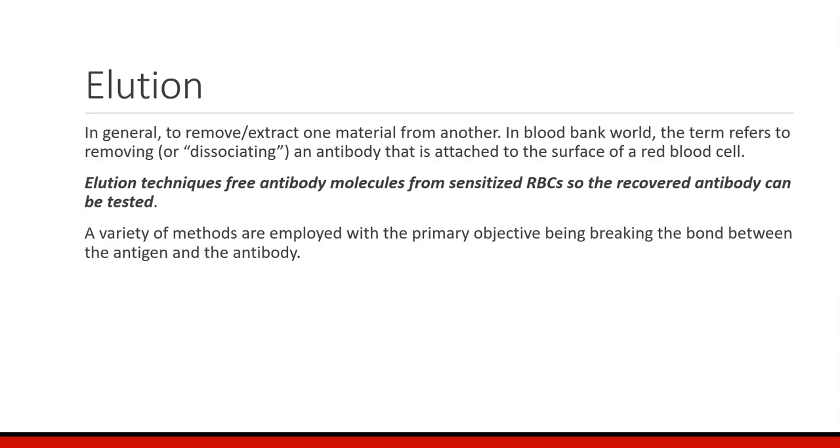We used to do these all the time, especially for ABO hemolytic disease of the newborn, because there's a very easy technique that we can do, but these have become less frequently used. And when we get to that section, I'll talk more about why elutions are not as necessary, except for certain circumstances as before.